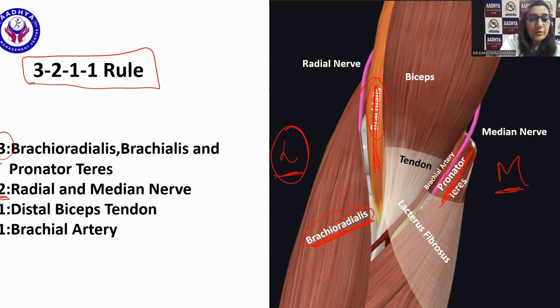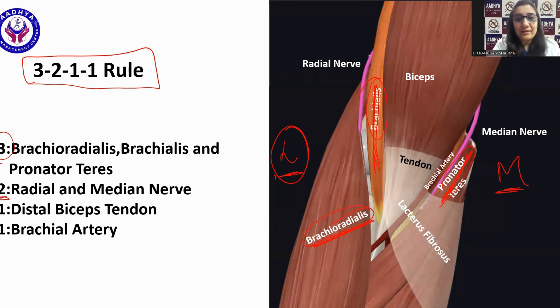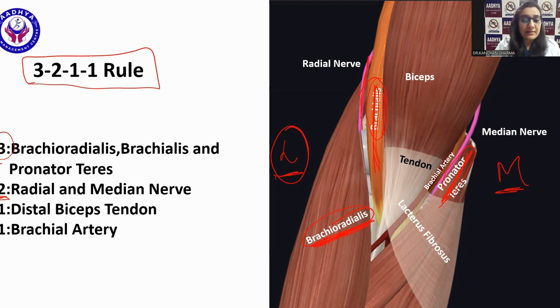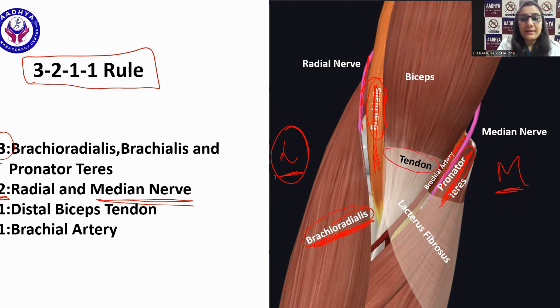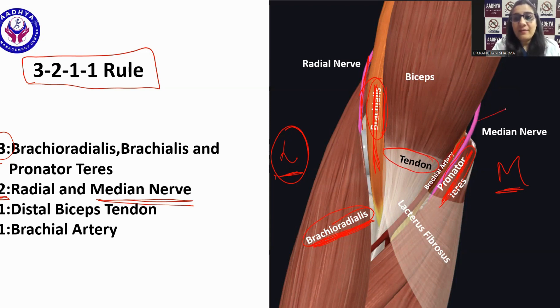The 2 stands for 2 nerves. The radial nerve is present in an oblique fascial plane between the brachioradialis and the brachialis. The median nerve lies between the brachialis and the pronator teres. Then there is 1 tendon — the distal biceps tendon — and 1 artery — the brachial artery.